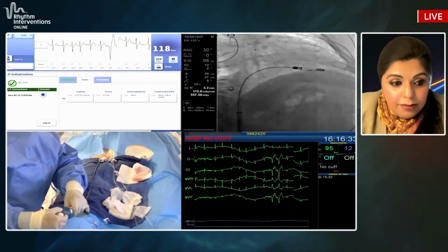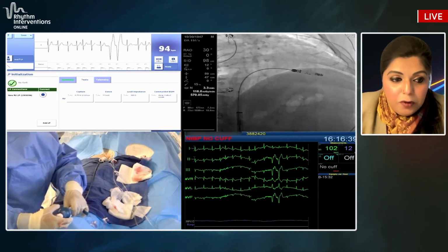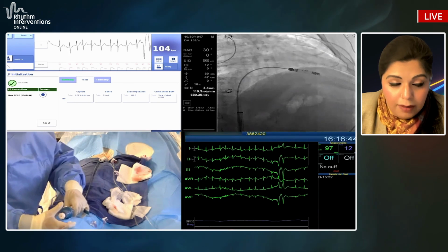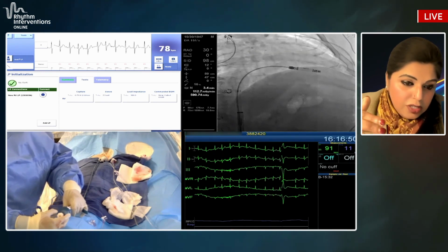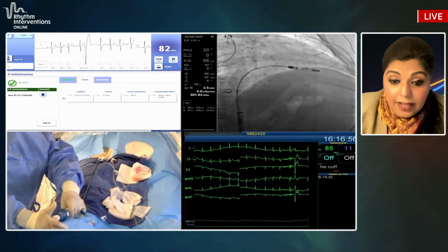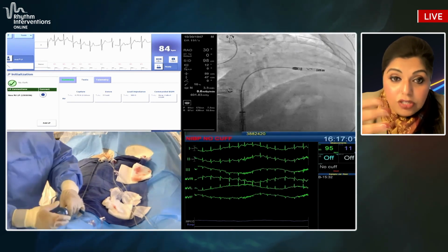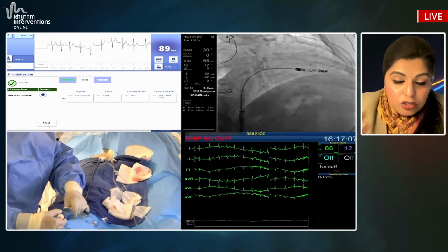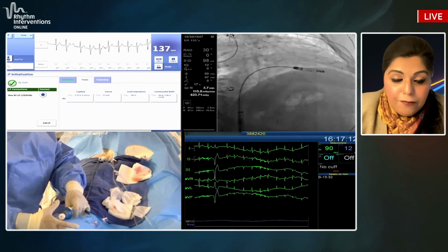And what I'm using is that blue control knob to turn in the clockwise direction. And it's almost 1 click per second. You can see I'm going very slowly as I'm turning the control knob in the clockwise direction, watching that chevron move. And you have to pay careful attention to that torque transfer, especially in a very convoluted IVC. The torque transfer can be late, so you want to make sure that the pacer is not rotating too fast. Once it comes to a full rotation, I'll stop, let any of the additional torque that has built up move forward, and then not go beyond 1.5 rotations.